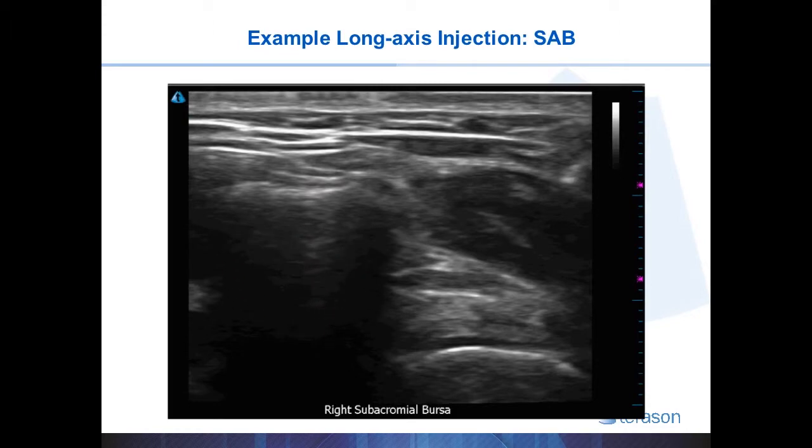Here is the hypoechoic bursal fluid. The rotator cuff is just below that, showing a relatively hyperechoic fibrillar pattern of tendon. Right below that is the hypoechoic or anechoic hyaline cartilage of the joint. And here the hyperechoic line represents the head of the humerus.